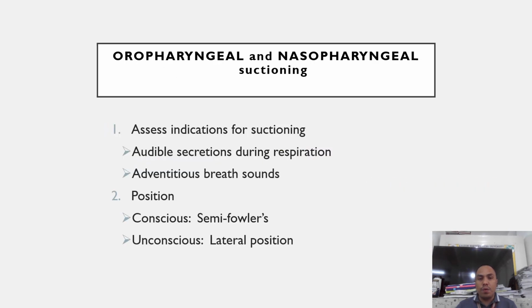Okay, so in doing oropharyngeal and nasopharyngeal suctioning, we first need to assess the indications for suctioning. So what are the indications for suctioning? Number one, audible secretions during respirations, and adventitious breath sounds. So that is for our first assessment of indications for suctioning. And number two, we have the positioning. In positioning, if the client is conscious, awake, it should be semi-Fowler's. If unconscious, not awake, that is the lateral position.